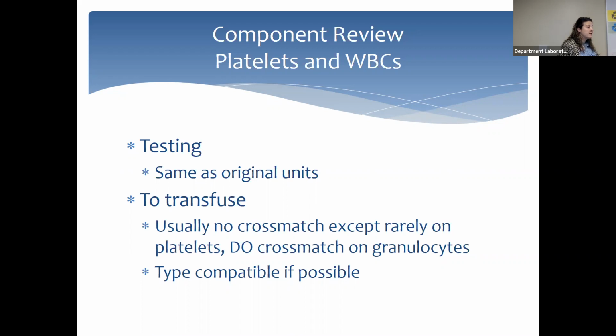If your patient has a platelet antibody, it will be circulating in their plasma. UAMS actually does that. We do platelet antibody identification and platelet cross matches. And the HLA lab will do HLA testing on our donor platelets to find HLA match platelets. However, sometimes we will just order HLA match platelets because it's easier to order them from a donor center.